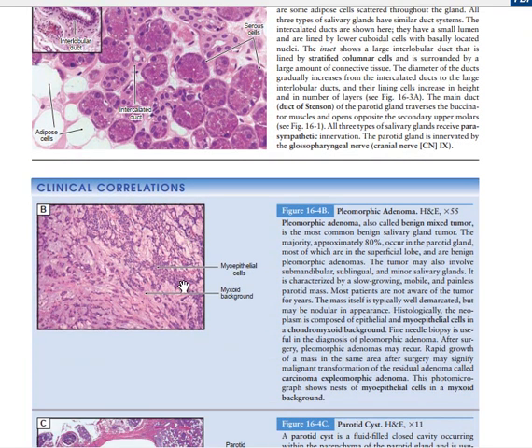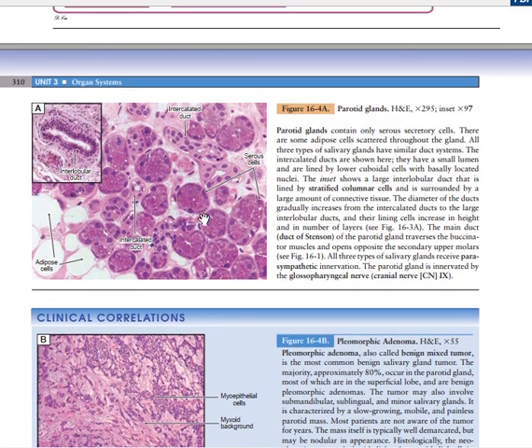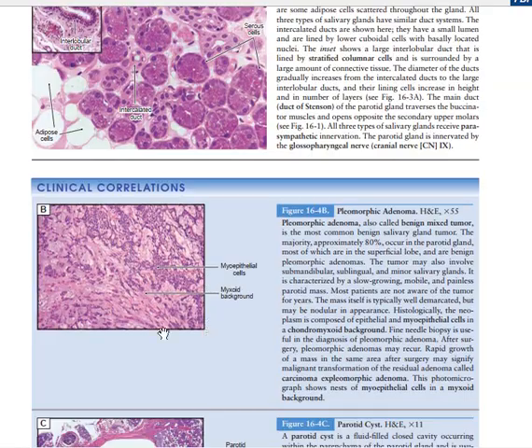Now you need to know that the serous cells are columnar cells. As you visualize here, the nuclei of the columnar cells are mostly located at the base, and there are granules at the superficial aspect, at the apex of the cells. Is it clear? The apex of the cells is also pink or purple staining because it contains granules which contain the proteins of the serous material.